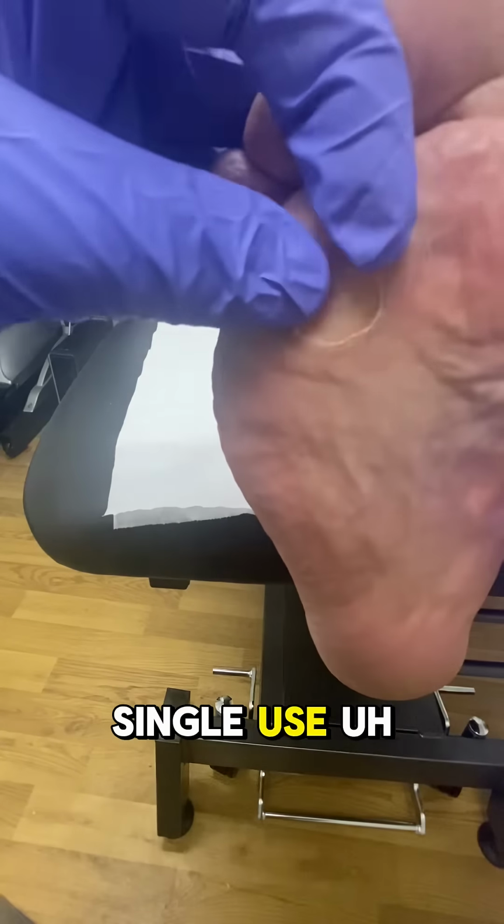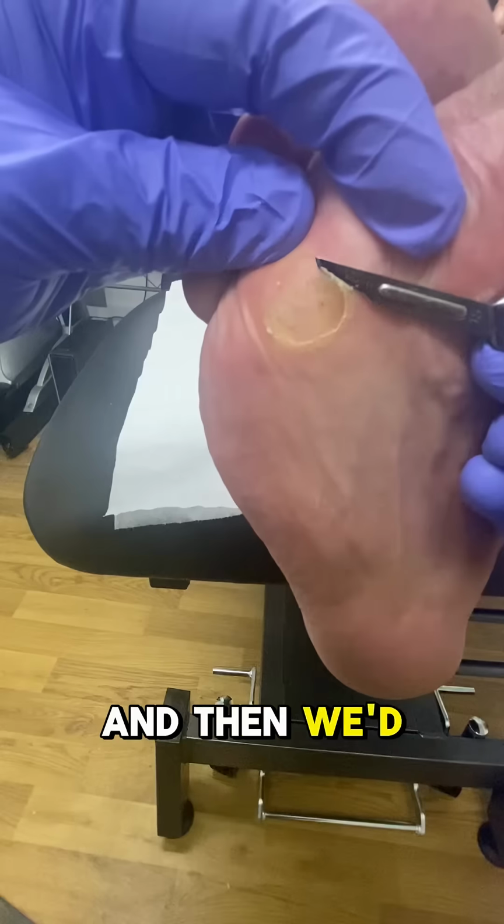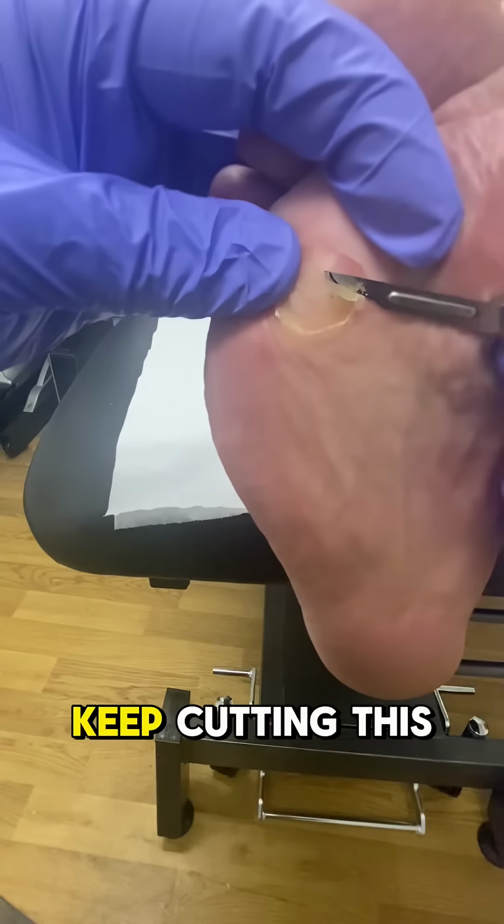Now, these are single-use Swann-Morton blades, of course. We use them just for this job, and then we dispose of them or recycle them. So we keep cutting this down.